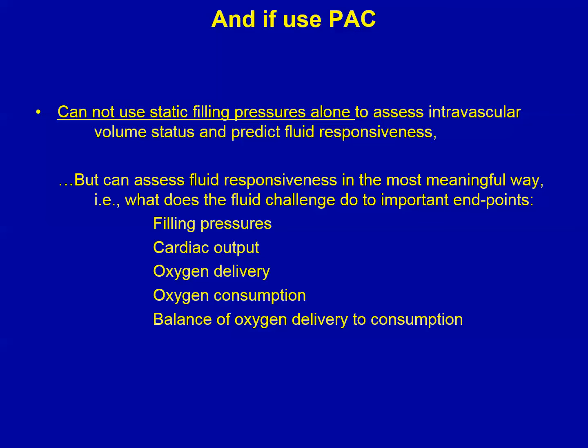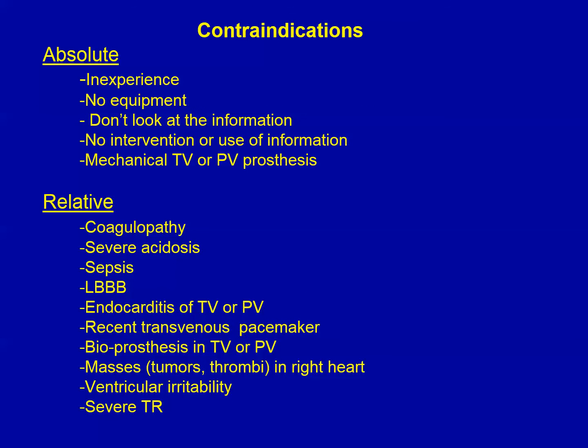Finally, one cannot use static filling pressure alone to assess intravascular volume status and predict fluid responsiveness, but as I've mentioned before, that doesn't mean the PA catheter isn't helpful in managing fluid therapy in these patients.